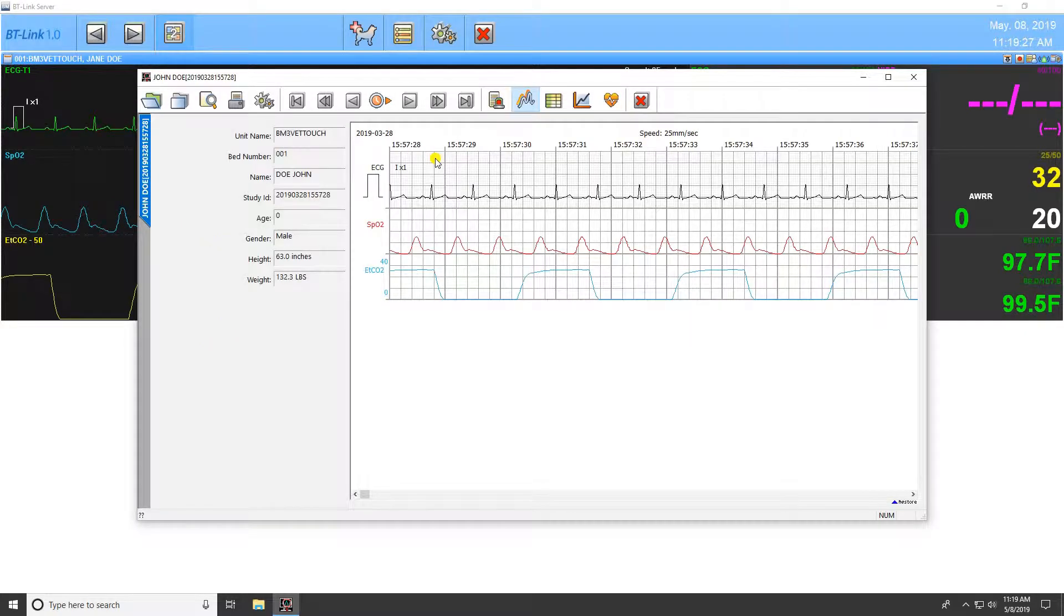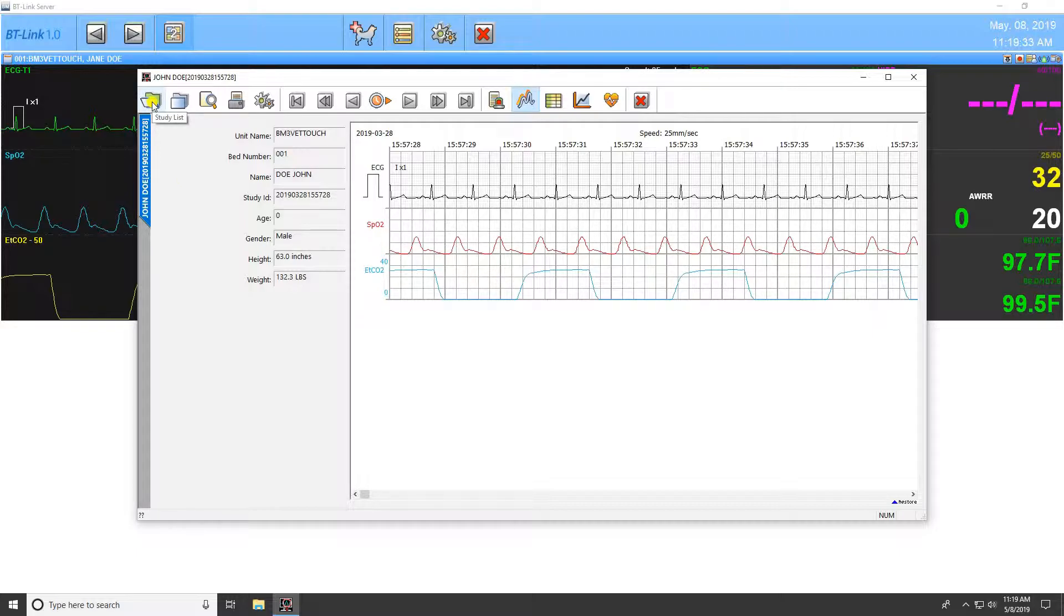Double click a study from the selection field to open that patient study. Let's review the icons at the top of the program. The first icon is the Study List icon, which will bring you back to this screen from any selected study.